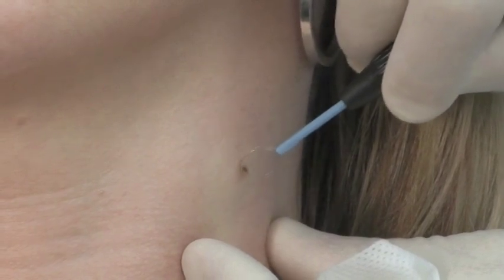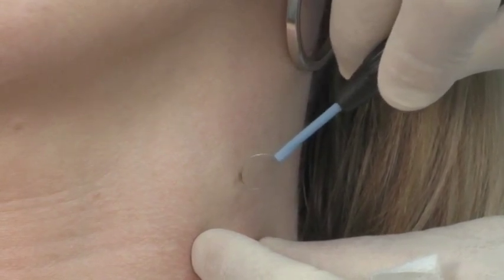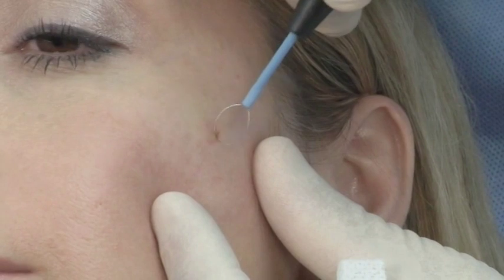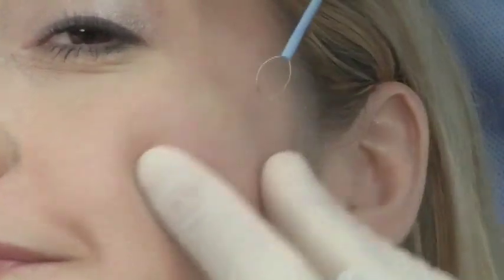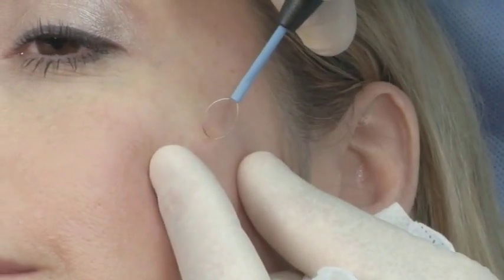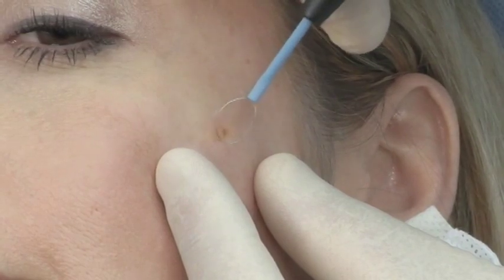You can see we go down into the papillary dermis and probably down even into the reticular dermis at times. If it's a seborrheic keratosis, of course they're more superficial, so we don't need to go quite as deep. That takes it off very, very quickly. The nice part about the radiofrequency device from Elman is it generates very, very little char — it just gives you enough, but it won't affect the remaining dermis, so you get better healing and therefore less scarring.